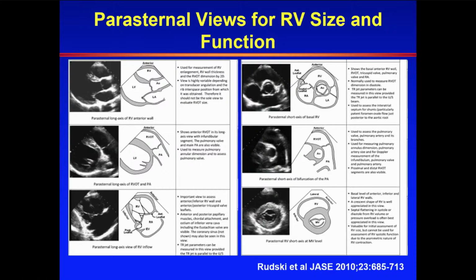Linear dimensions, unlike areas and volumes, are not indexed to body size and not necessarily different between men and women. This is in part reflecting that the data that was used to generate them did not make these distinctions. But as you imagine, dimensions, just as areas and volumes, do relate to the body size of an individual.